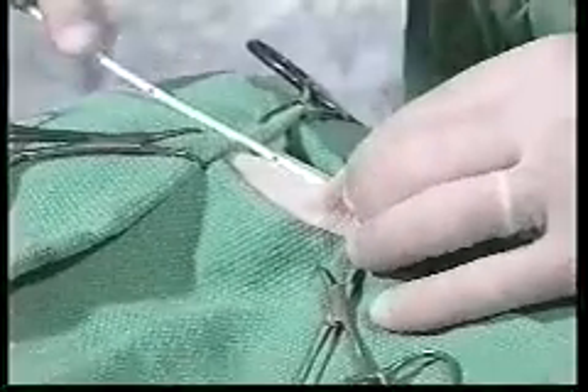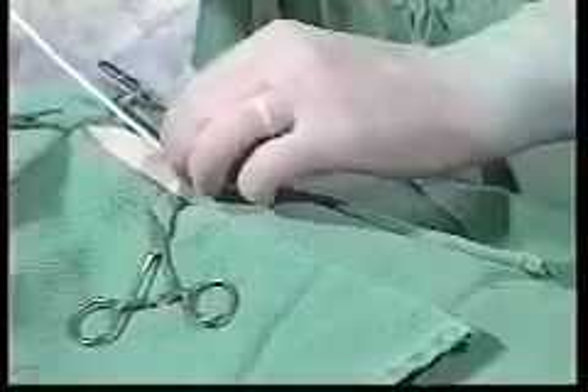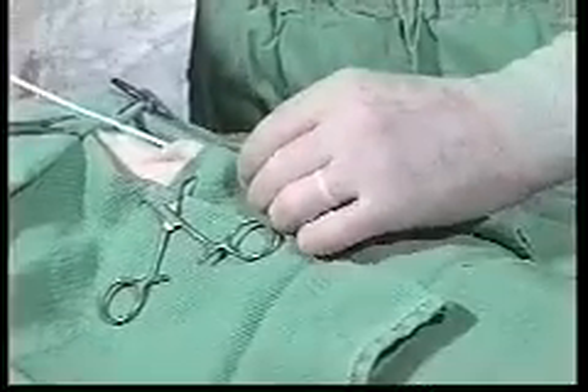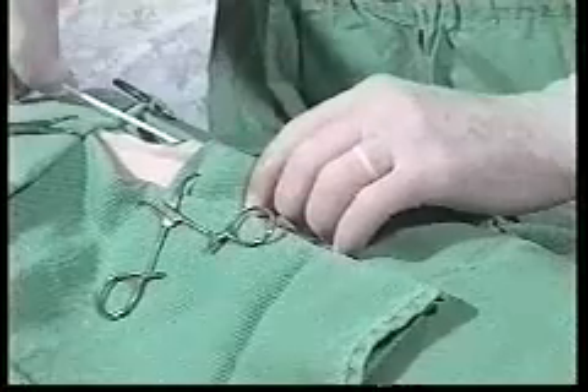Now we are going to start to slide. In very thin cats, we are going to meet some resistance right over the shoulders, and then the tube is going to slide on into place. In fatter cats, generally the tube will just slide on pretty easily. But don't worry about that resistance — I just went through it right there. Now I am picking up the tube right here and allowing it to feed through my fingers, forcing it right down the side.